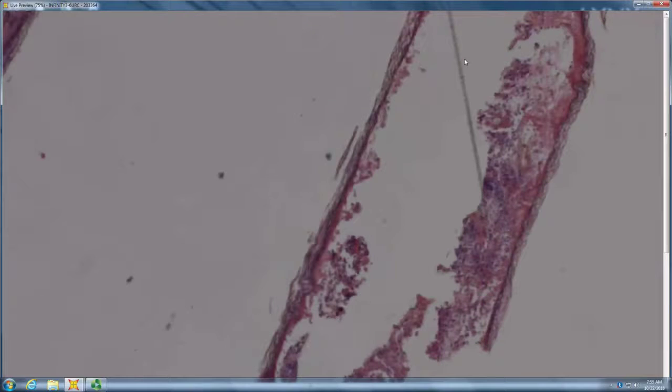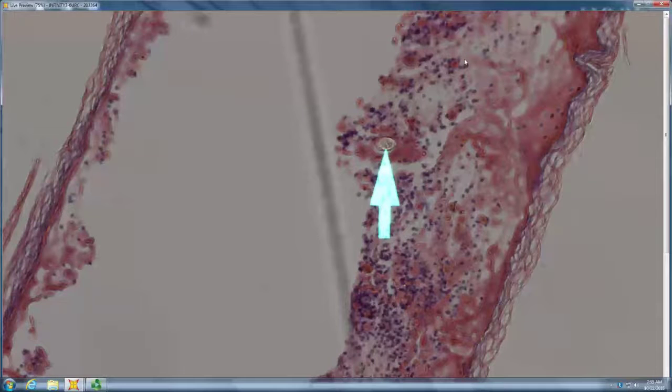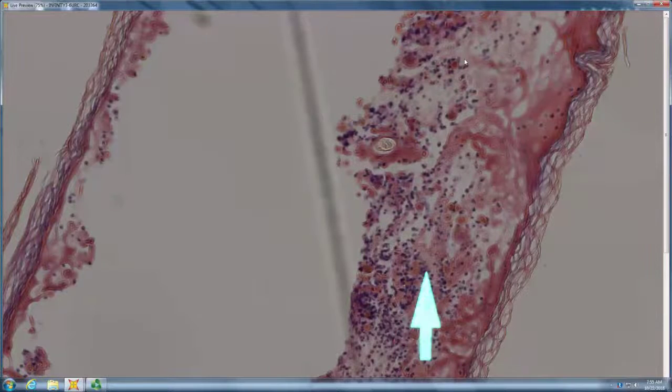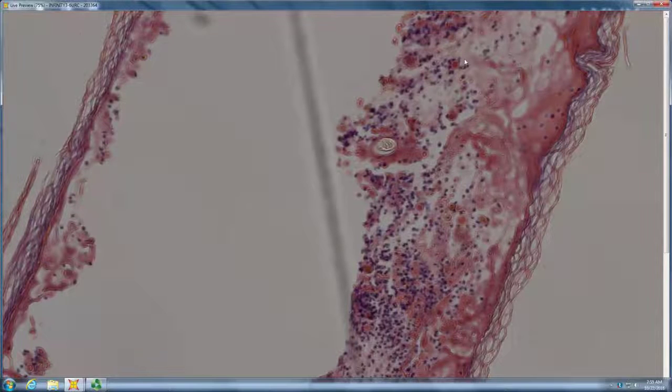The horn is acute, so probably more like an EMSJS. What's that structure right there? Oh, hair follicle. Does EMSJS usually necrose the hair follicle? No. Is this purely lymphoid, or is it mixed with neutrophils and neutrophil debris? More mixed. And are these cells normal, or do they show ballooning degeneration? Ballooning degeneration. So what causes acute necrosis of the follicle, a mixed infiltrate and ballooning degeneration? VZV. Yep. Acute zoster.